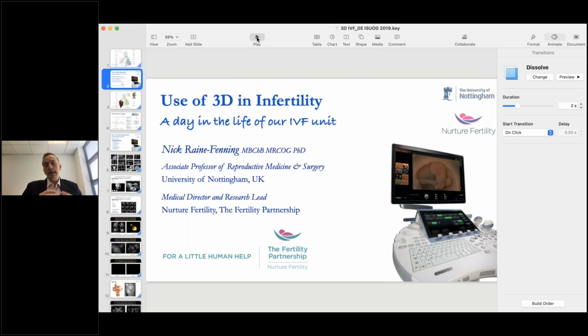I've been asked to talk to you today more specifically about IVF. Now, I know not all of you are IVF practitioners, but I'm sure that some of you are, and some of you that are involved in fertility will be referring patients on to IVF clinics. So I think hopefully what I'm going to share with you will resonate and have relevance for all of your work. And what I wanted to do is really just take you through what we do every day, 7 days a week in my unit. We work Saturdays, Sundays. That's more for the general monitoring of patients, but certainly Monday to Friday, what I'm going to share with you is exactly what we do every day and have done for many years.